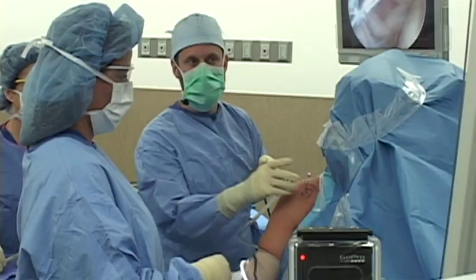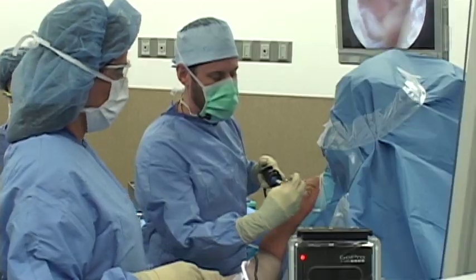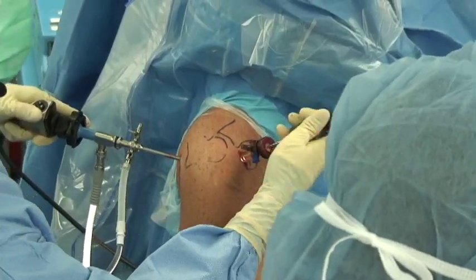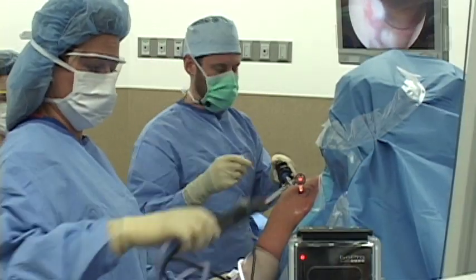Now we're going to put a separate opening into the shoulder through the front. We'll make a second incision in the front of the shoulder, and through it we'll put a small tube called a cannula. Now we have an opening, a way to get into the front of the shoulder joint. And we'll just clean things up just a little bit to start.